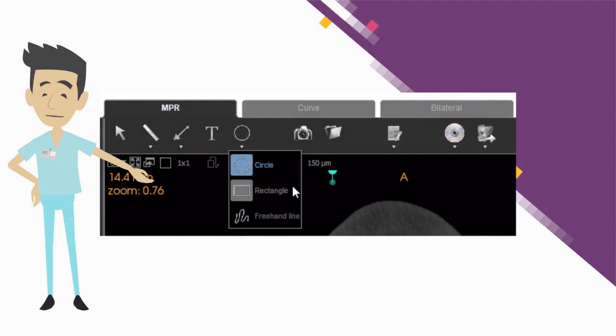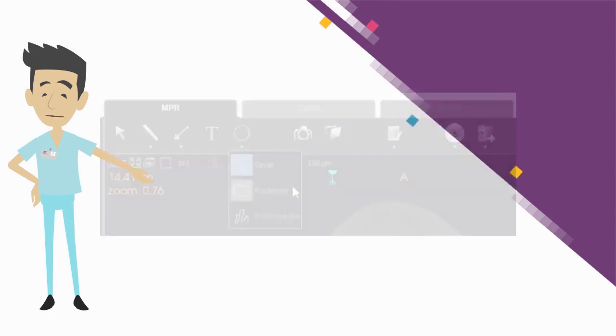New annotations and drawing tools have been added: arrow, circle, rectangle, freehand drawing, and text edit.